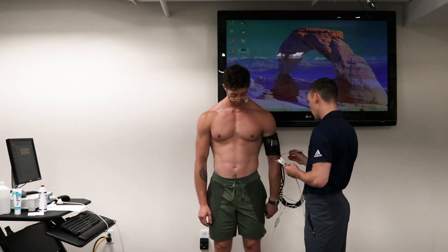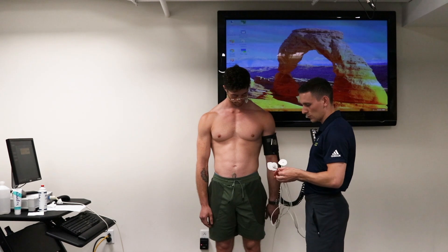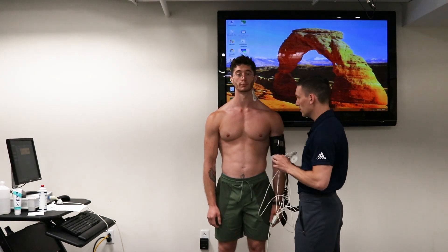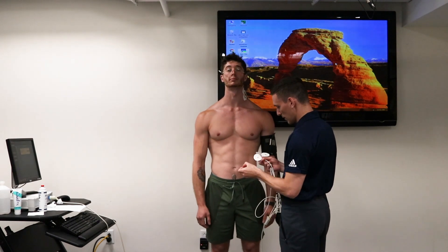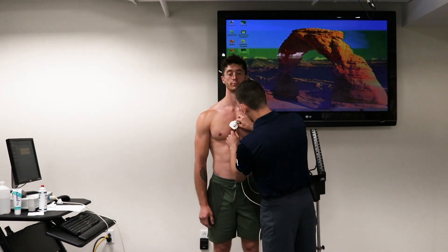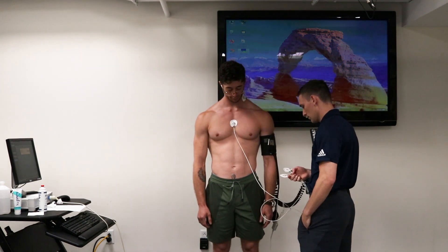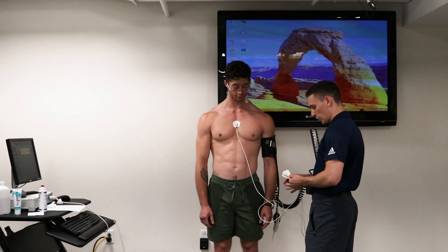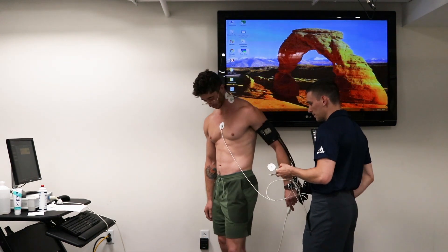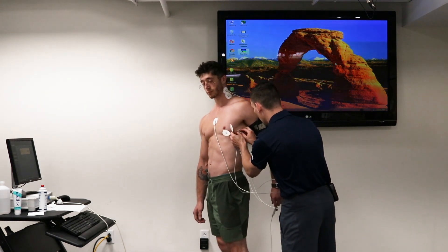The next one is the sternum, and we're going to use our red lead. That spot is nice and red already, so go ahead and stick that right on. Next we're worried about is our V6 lead — we've got our orange lead for that one. Go ahead and stick that right on.